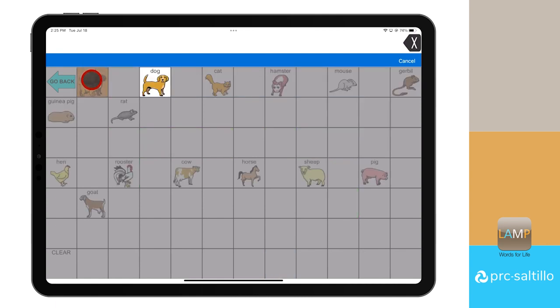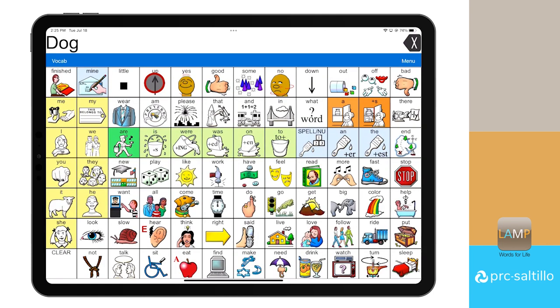Continue to select the highlighted icons until you get to your chosen word. Once you have found and selected the word you were searching for, all icons in the vocabulary will be visible again.